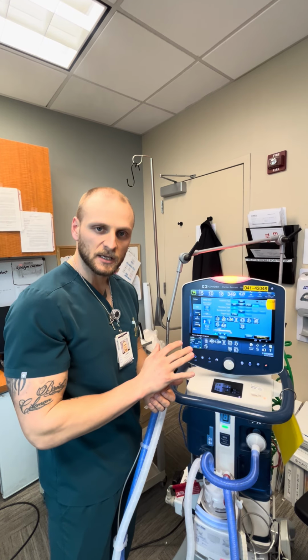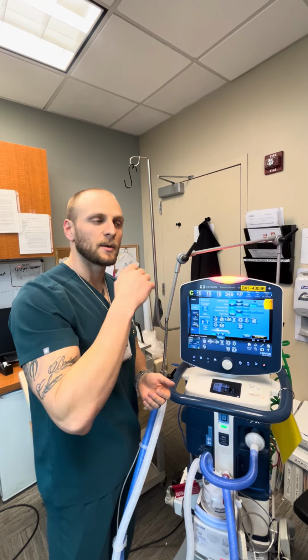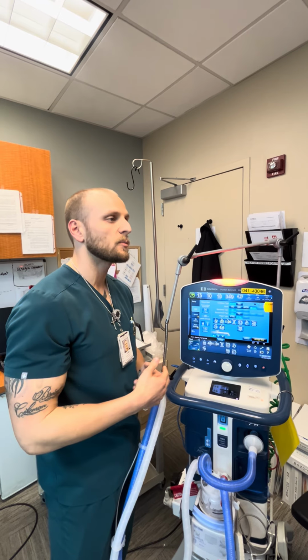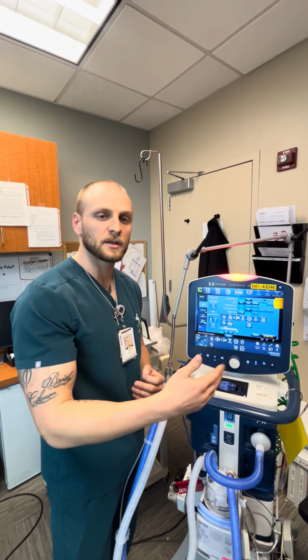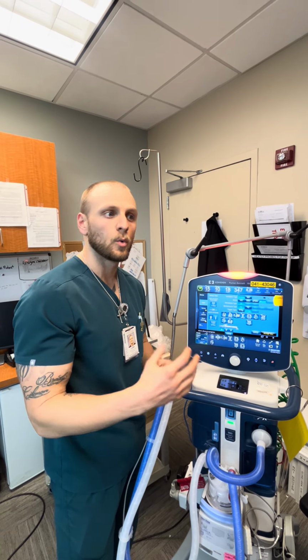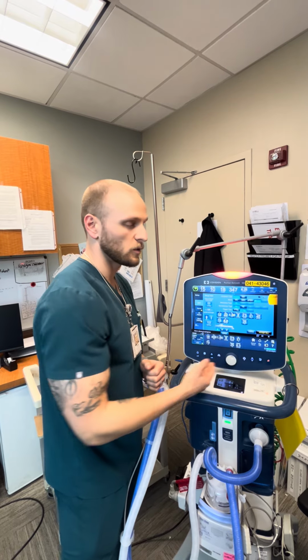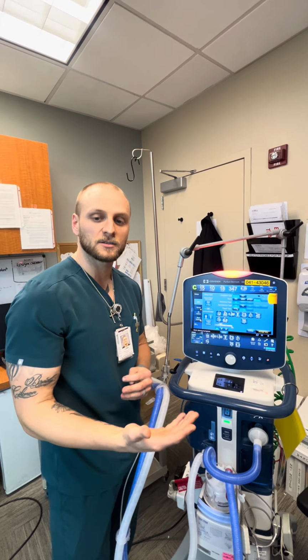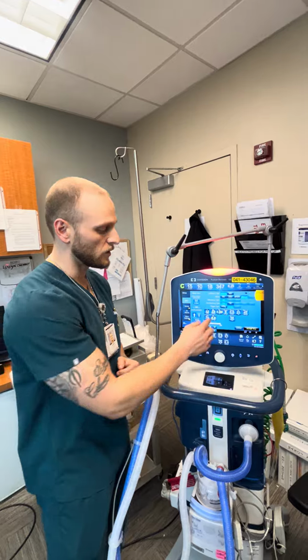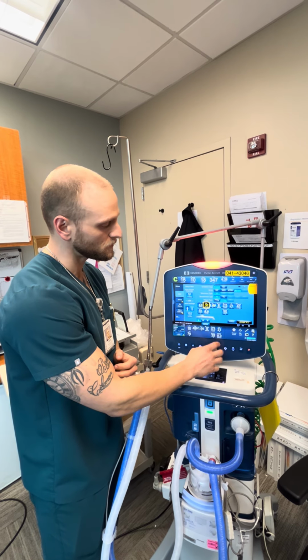Caveat to both of those things is we will never exceed a pressure of 30. In other words, if your patient's plateau pressure is 33, 34, which is not uncommon for a patient with really, really stiff lungs, we're just going to go ahead and set that patient's P high at 30, okay? So we're going to assume we got really, really stiff lungs, our plateau pressures are through the roof. We're going to put this guy or gal's P high at 30.